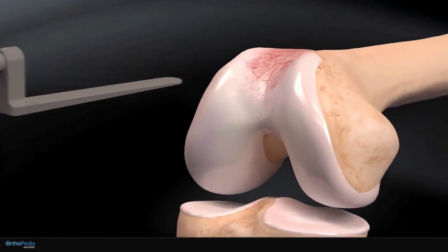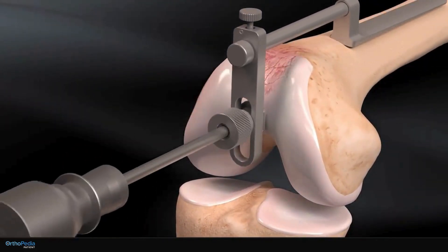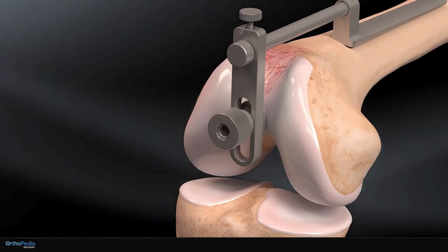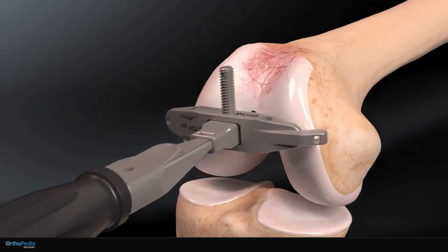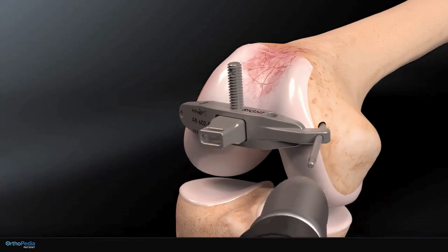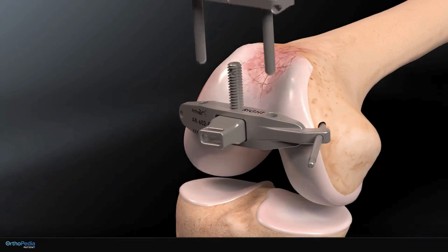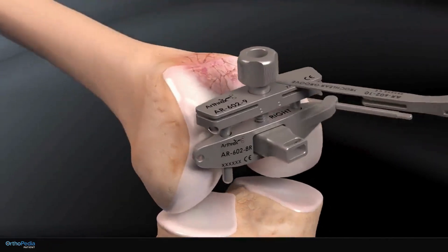A guide is then inserted over the end of the thigh bone and a drill is inserted through the hole of the guide to make a hole in the bottom of the thigh bone. The guide is removed and a sizing base is inserted into the drilled hole. A metal pin is placed through the base on one side of the knee to hold it in place.